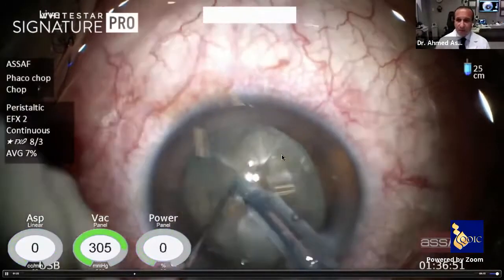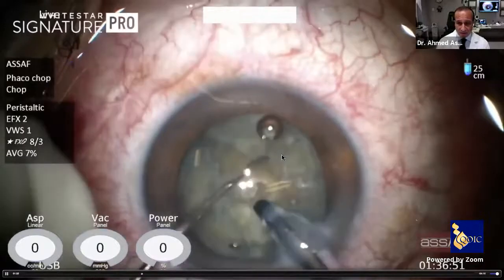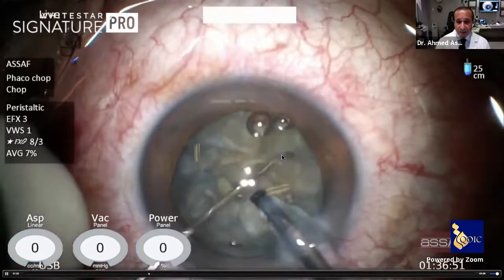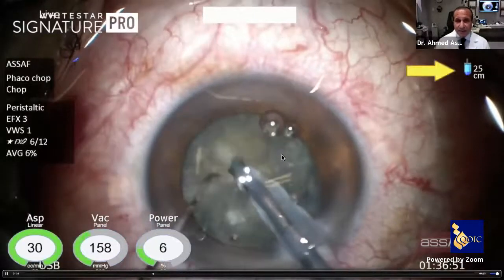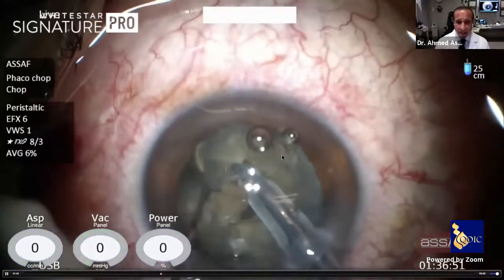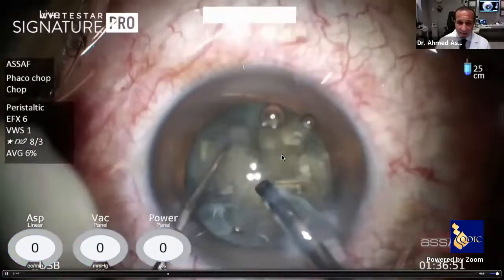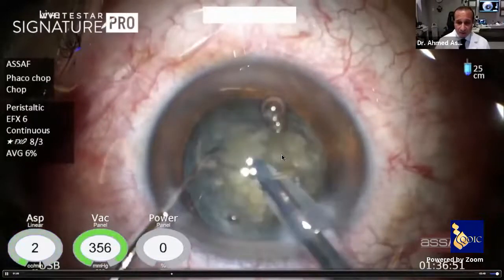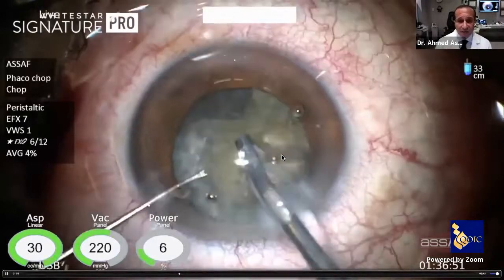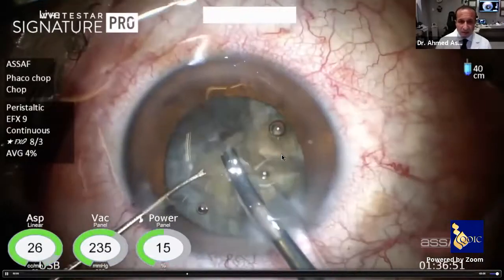Regarding the phaco technique, we can employ any technique as the surgeon wishes, but I prefer the quick chop technique with vertical chopping. You can see that the nucleus is now pretty mobile within the lens capsule, because I believe vertical chopping is the least stressful technique on the jeopardized zone. Again, we can lower the bottle height to make those fragments within the lens capsule more accessible. Once we have completed our chop, we can raise the bottle height and retrieve those fragments from the lens capsule to the anterior chamber and do the phacoemulsification in the supracapsular plane.